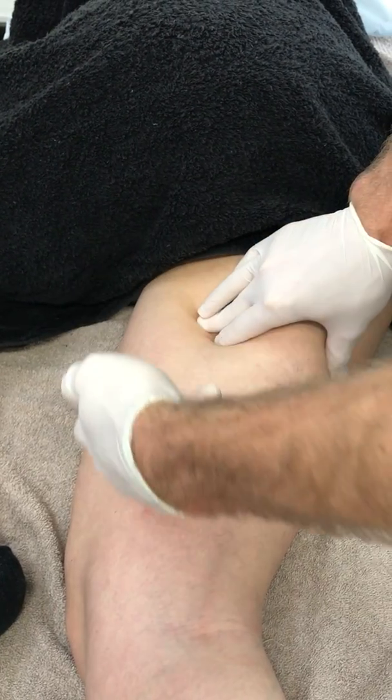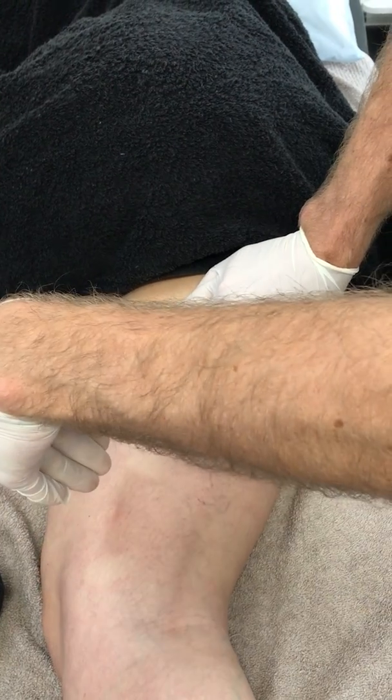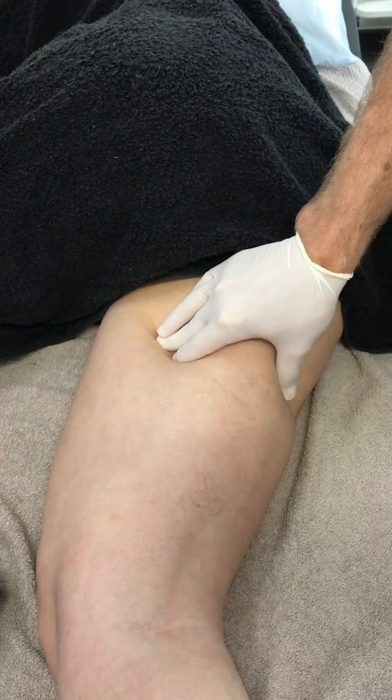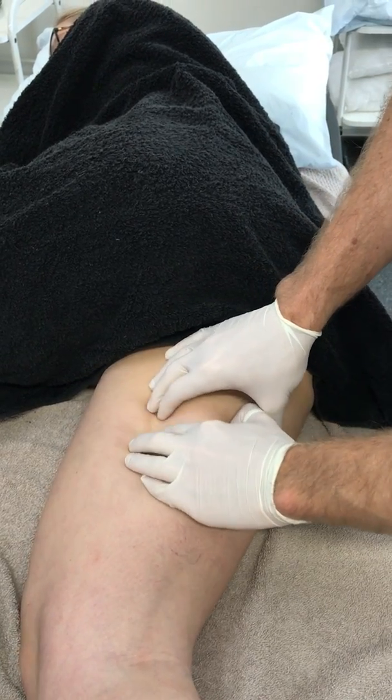So in the sort of roughly the proximal 2/3 of the muscle, you'll needle posteriorly, because the femoral artery runs anteriorly until it goes through the adductor hiatus down through here, where you think about depth as well as you also think about needling anteriorly to avoid the femoral artery. So this, I've isolated the muscle here.